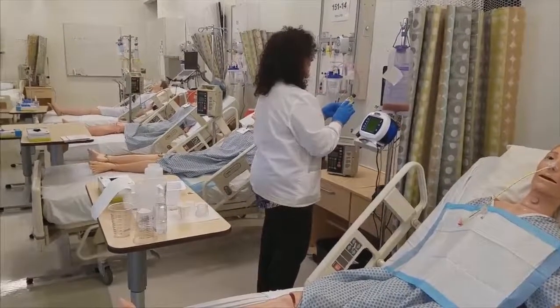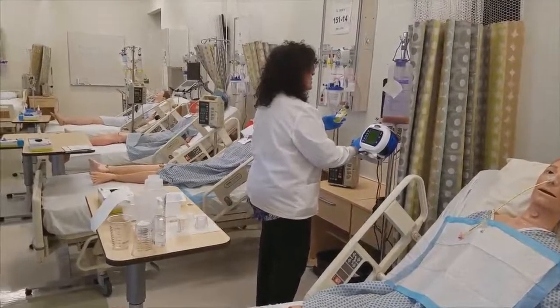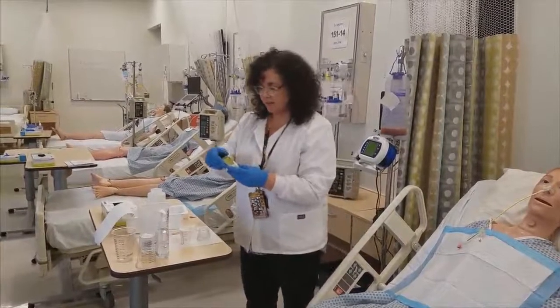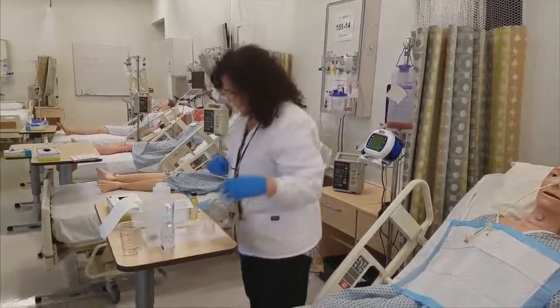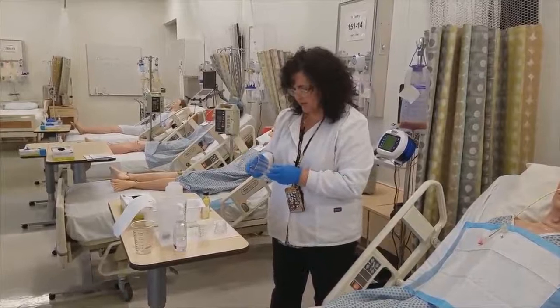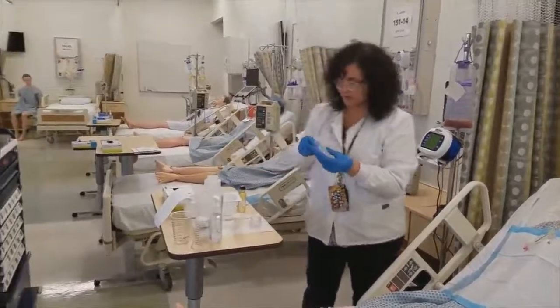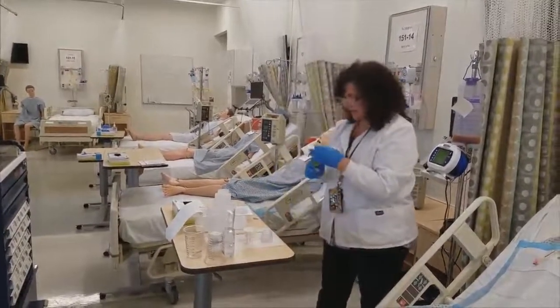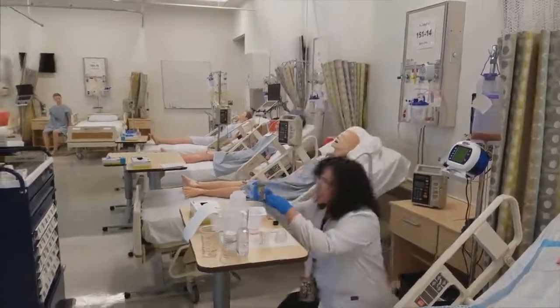Okay, I have 10 grams per 15, and I have a 30 gram dose. Based on my med math, I know that I need 45 milliliters for my 30 gram dose. I'm going to make sure I use a nice clean cup. I'm not going to use the one that I put the GRV in. Actually this one doesn't have the exact marking that I need, so I'm going to use a combination of these two. I'll put 30 in one and 15 in the other. Palm the label and pour at eye level.